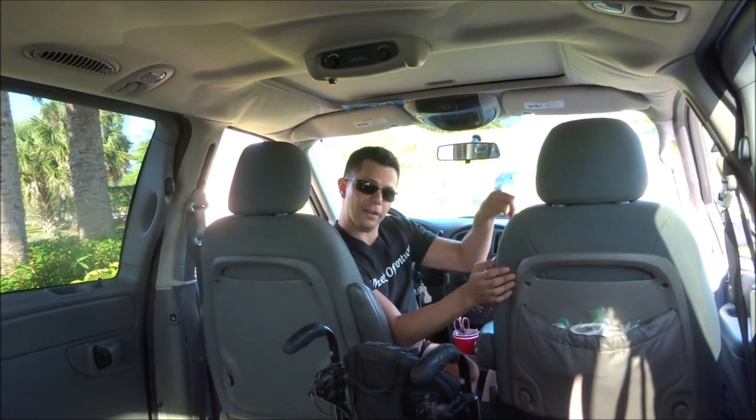Hey YouTubers! So this video is going to be an example of how I get out of my wheelchair ramp van if the ramp is blocked by a car on that side. I'm going to get the camera real quick and show you that it is in fact blocked.